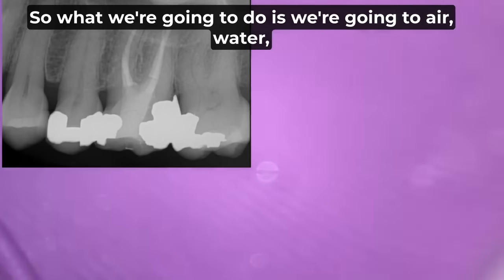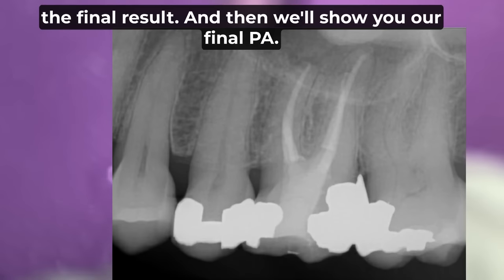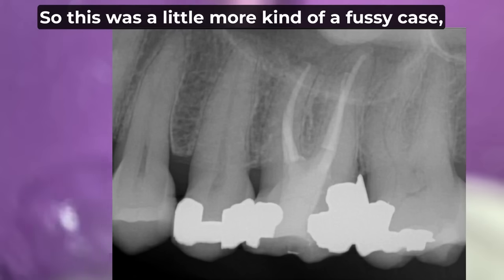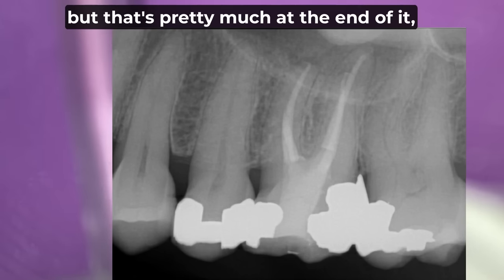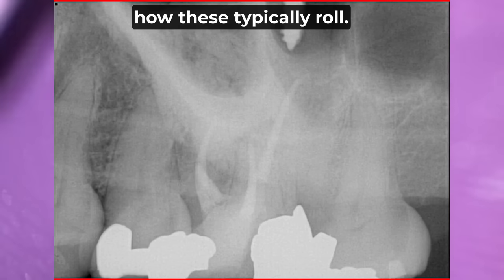So what we're going to do is air water rinse again, clean it out, and then we'll show you the final result, and then we'll show you our final PA. This was a little more of a fussy case, but that's pretty much at the end of it how these typically roll.